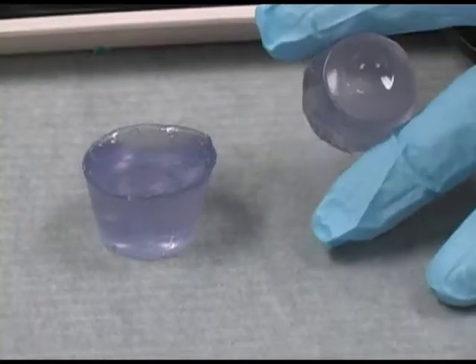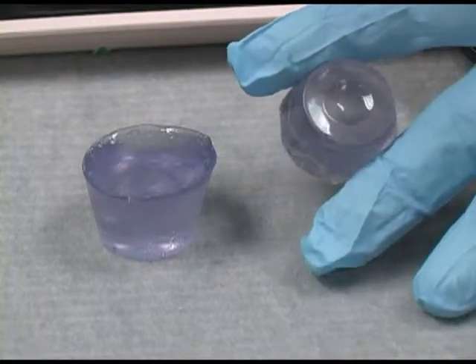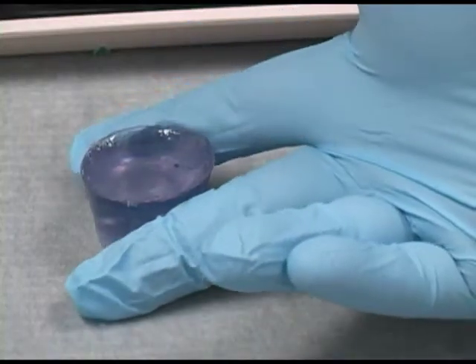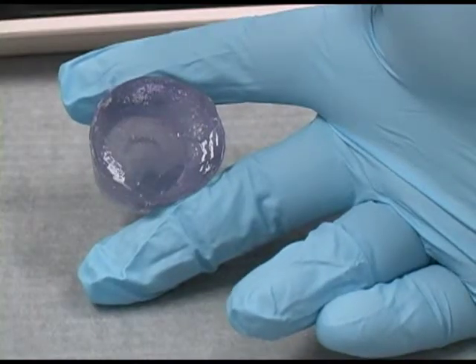As you will see, acrylic that has been placed in the pressure pot is free of porosity, while acrylic that has not been through the pressure pot has many air bubbles inside.